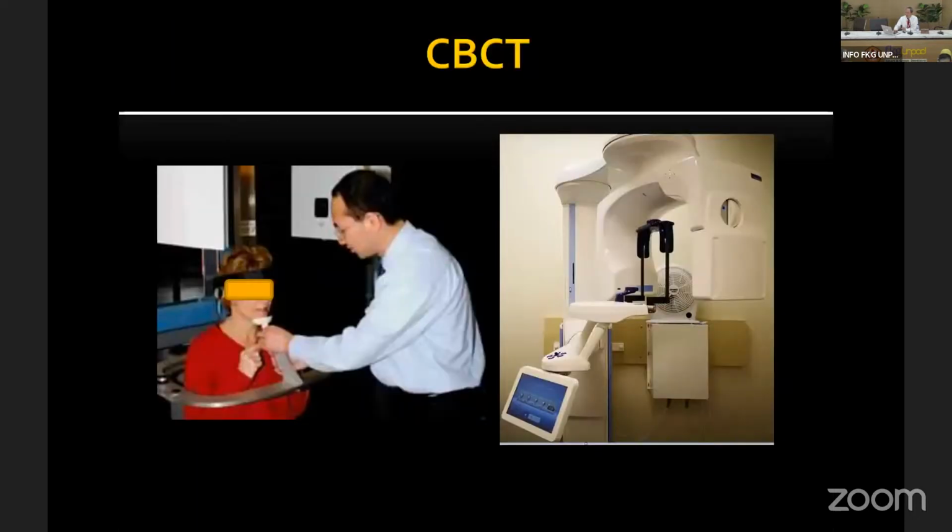So, the basic concept of cone beam CT. I know that you have a CT unit in the building, and certainly you would have some experience with cone beam CT. But the principle is similar to panoramic imaging.